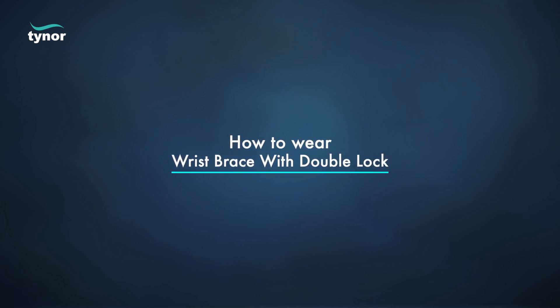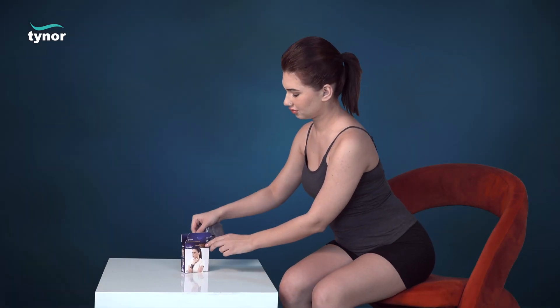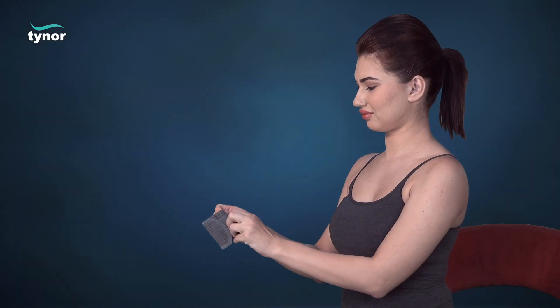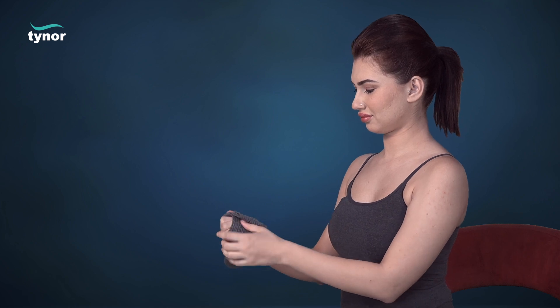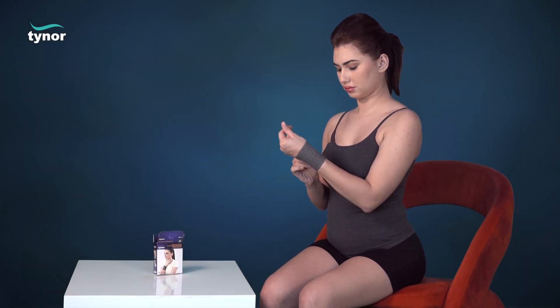Now let us see how to wear the wrist brace with double lock. Disengage the hook loop fasteners to make the product ready to use. Wrap the product around the wrist and fasten to a comfortable compression.